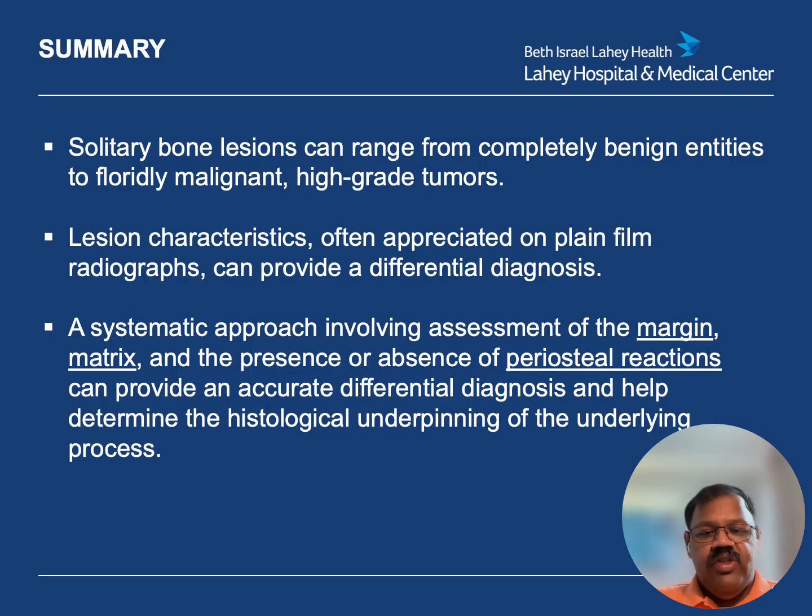So now that we've gone through this primer, basically what I want you to understand and take away from that portion of the talk is that solitary bone lesions can range from completely benign entities to floridly malignant high-grade tumors. The lesion characteristics often appreciated on plain film radiographs can help provide a differential diagnosis and really help narrow down the differential that you're contending with.